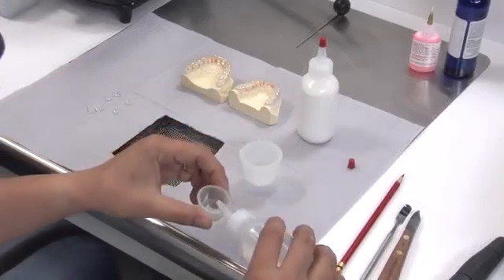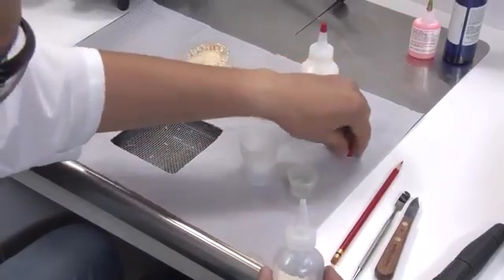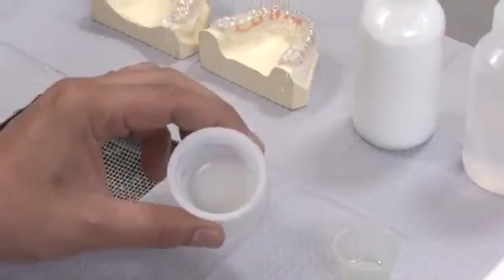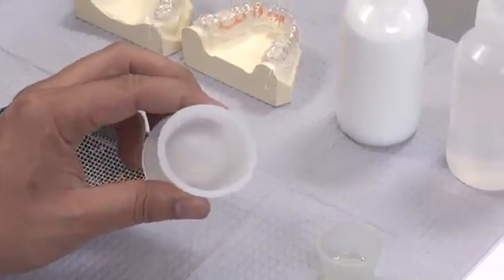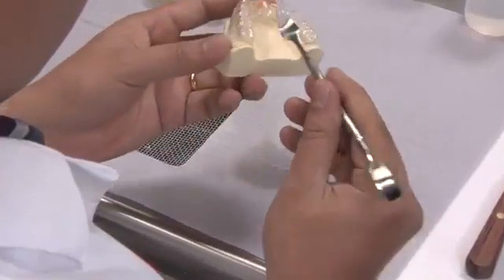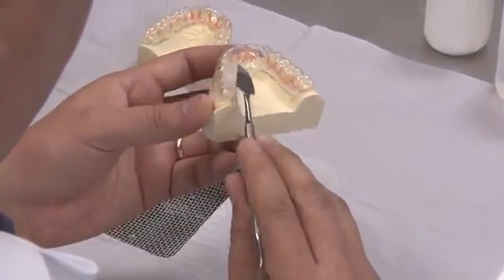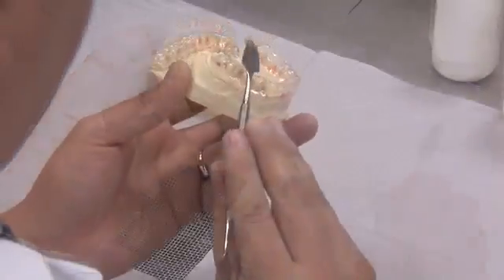Add a small amount of monomer to an empty mix cup. Check the mixture to verify its consistency. Using a spatula, scoop a small amount of acrylic mixture and place it on the areas above the first molar. Wet the spatula with the monomer liquid and shape.